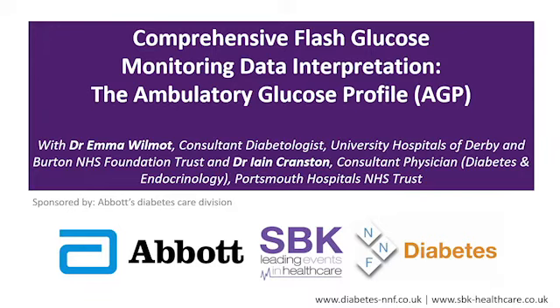So I think the first step for me is always to get an idea from that top section, which is the numbers. Because actually, if someone is achieving well, the one thing I do not want to find myself doing is criticizing someone who is achieving well. And I think most of us at heart, particularly those of us that have liked numbers, would see ourselves as perfectionists. Even in today's feedback groups we had that.